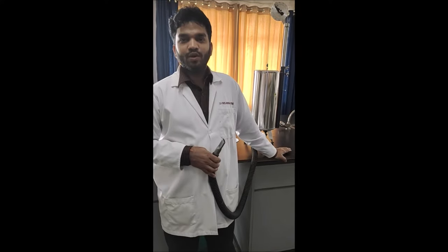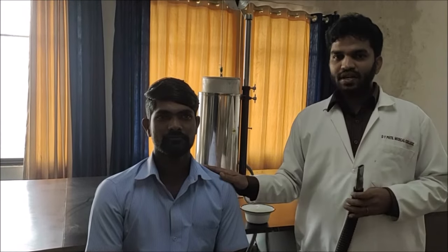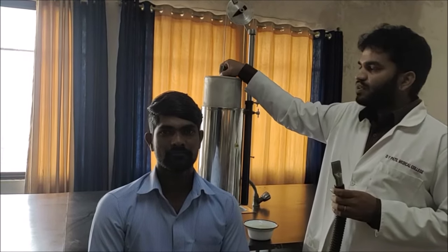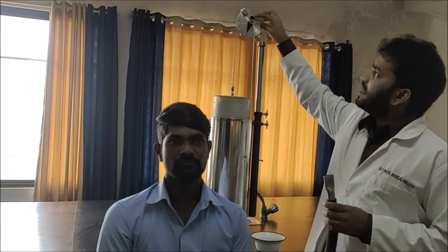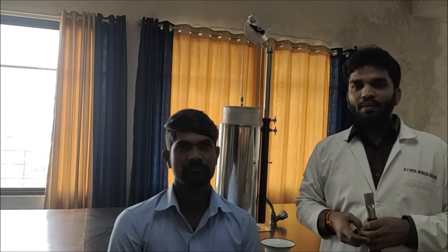Good morning everyone. Today I'm going to take the practical on the topic of spirometry. Requirements for spirometry recording: we require aseptic solution, the mouthpiece should be rinsed thoroughly, give proper instructions to the subject, check that the floating drum is moving properly, and before that we want to pour water in it so the floating drum works smoothly.